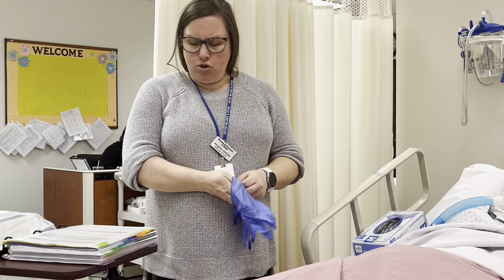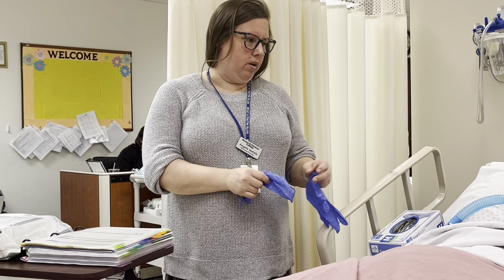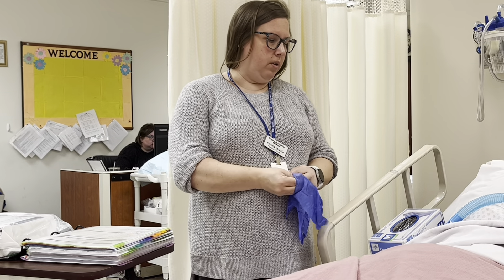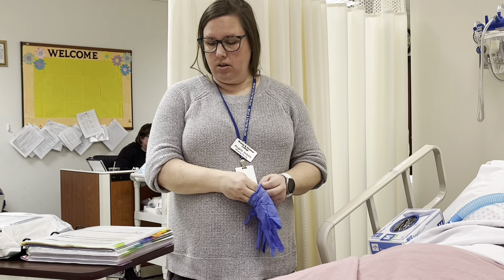Judy, do you have any allergies to strawberry and penicillin? That's good. You don't have any allergies to latex or iodine that you're not aware of? No. Okay, good. I'm here today to put in your Foley catheter. Do you have any questions? No? All right.